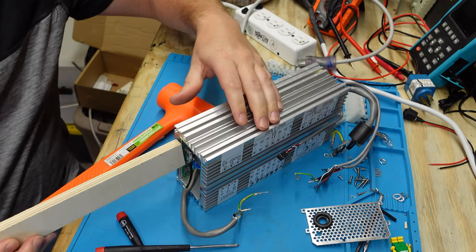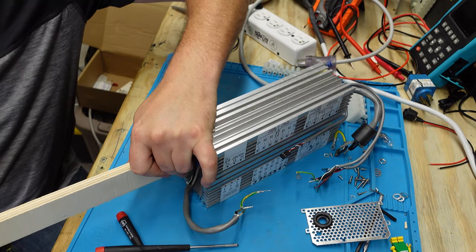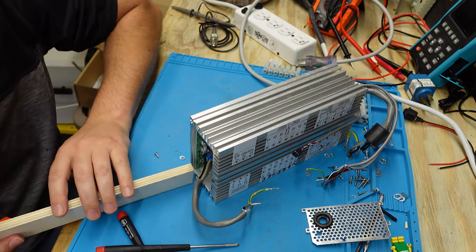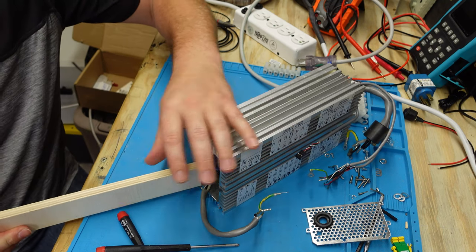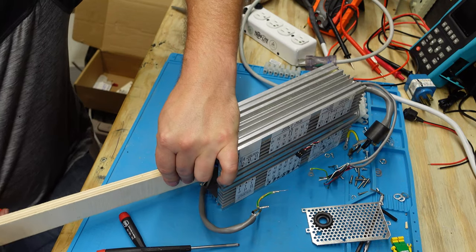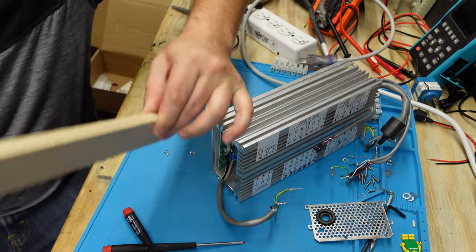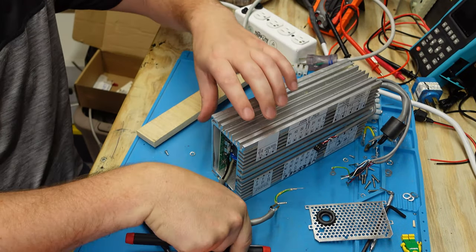Okay, so I'm going to use a dead blow hammer and a piece of board to see if I can get it to break free. Without a doubt, there is some sort of transfer thermal compound that is really maintaining this PCB so it won't slide out. So we gotta break that loose somehow.